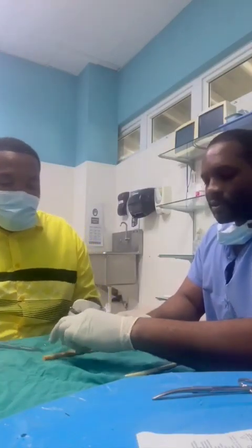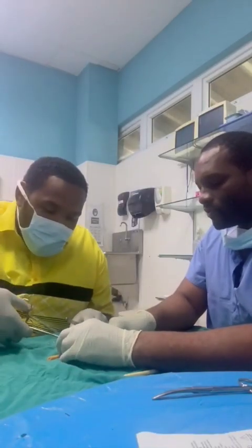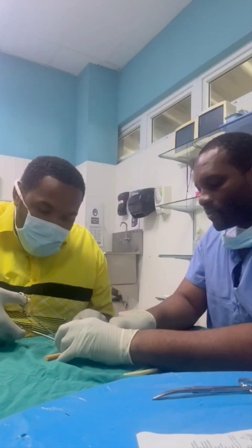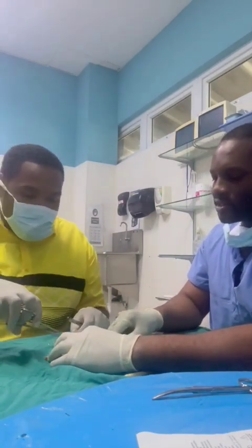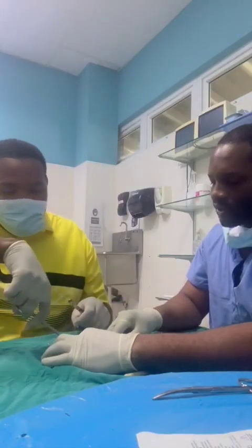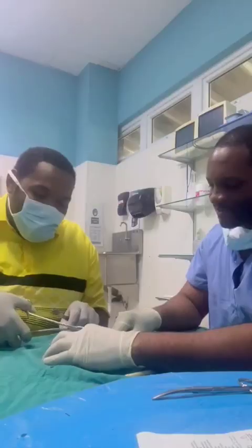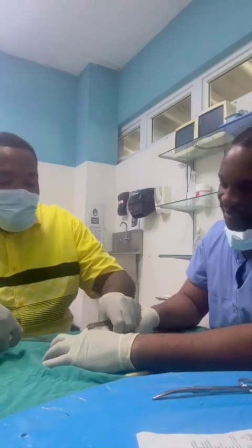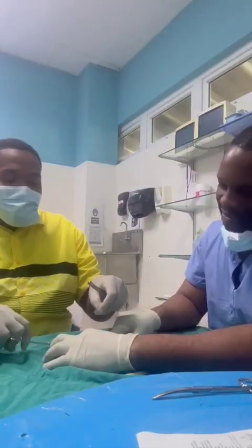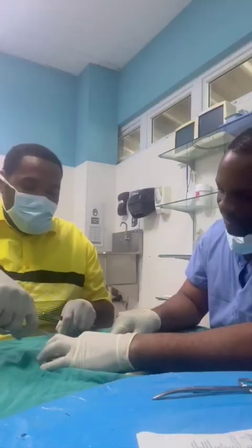Excellent. Can you just pull this through a little bit? Yes, if you don't mind. Excellent. That's a good job. I notice your knot is not on the incision. That's very good. You have done this before. One or two times. This looks more than one or two. Put it across. Very good.